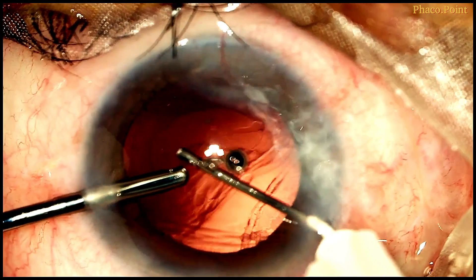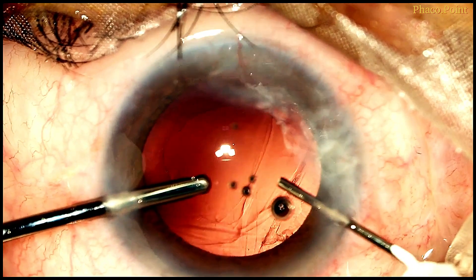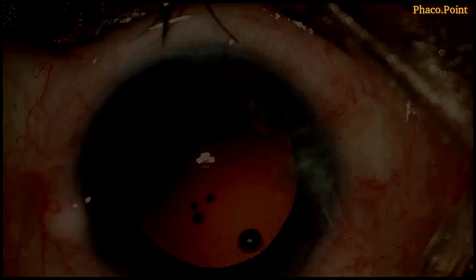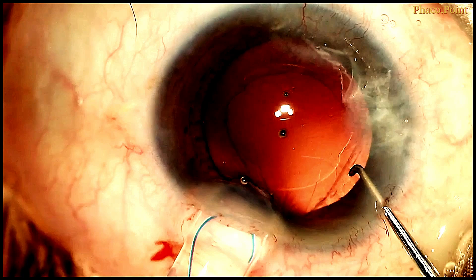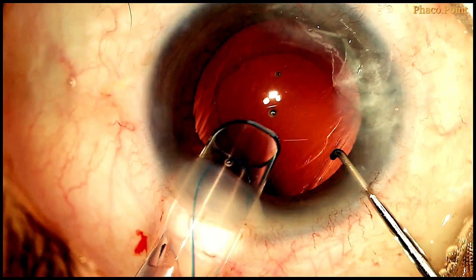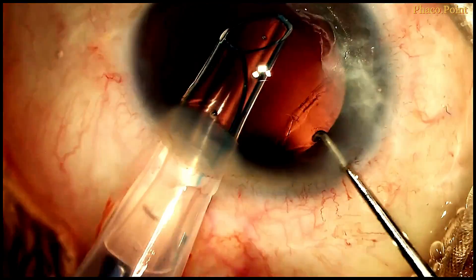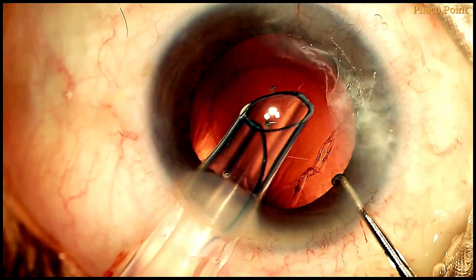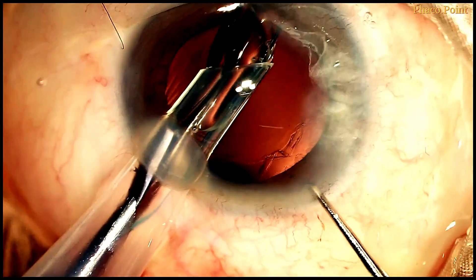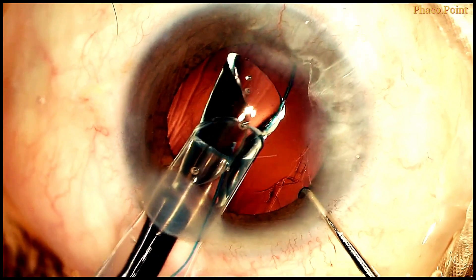A dispersive viscoelastic is being introduced whilst performing the visco-fluid exchange. We now move to the IOL insertion. Please note how the nozzle is introduced almost halfway into the anterior chamber within the wound — this is important to allow ease of entry of the leading haptic into the ciliary sulcus.